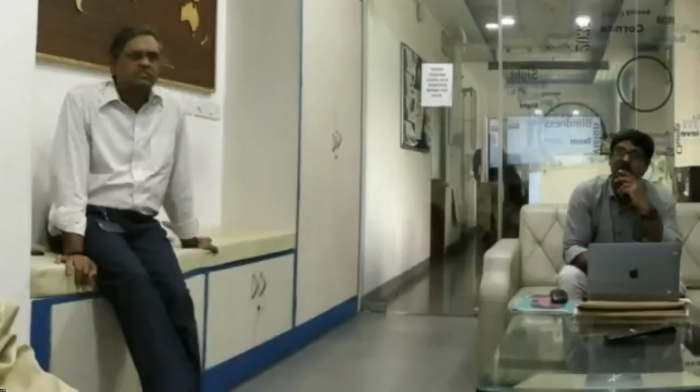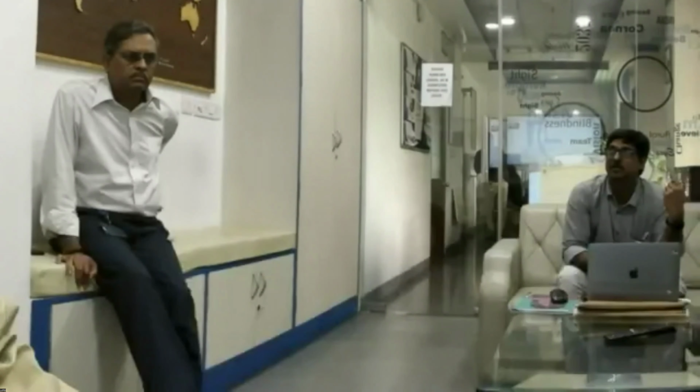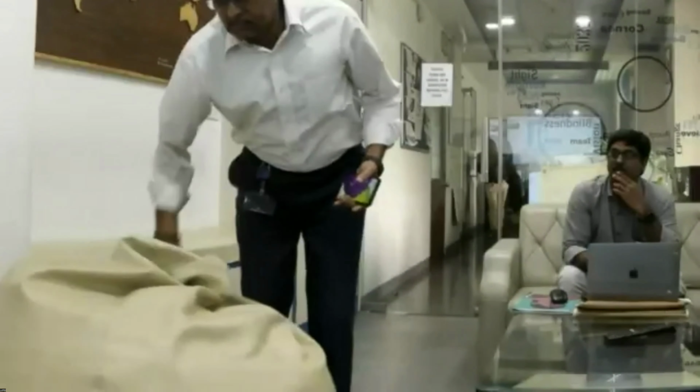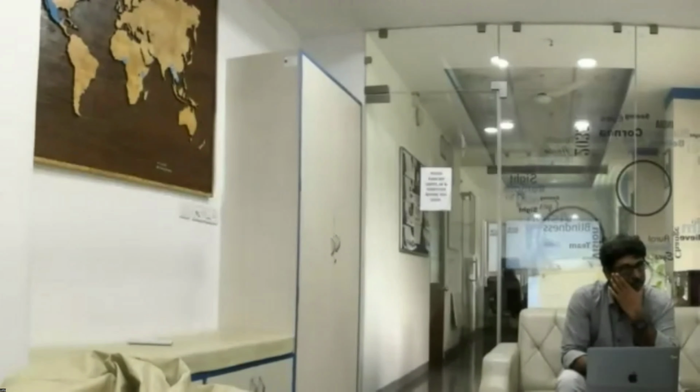Then we get the blood tested, and if the blood test is negative, then we make the corneoscleral rim. If it is seropositive or something else, we discard.